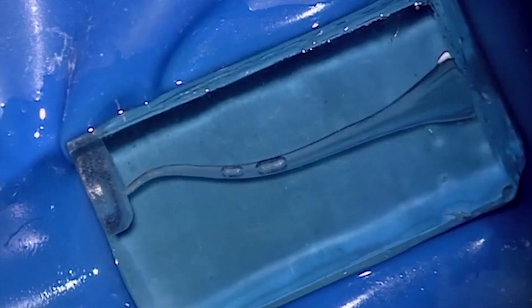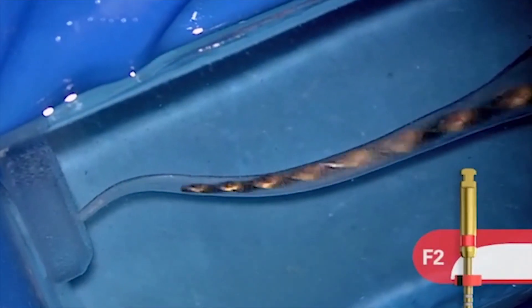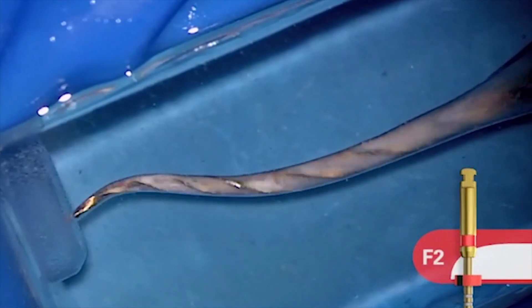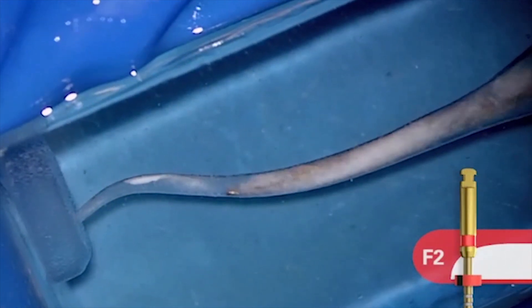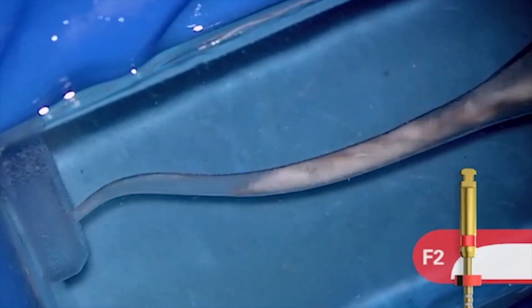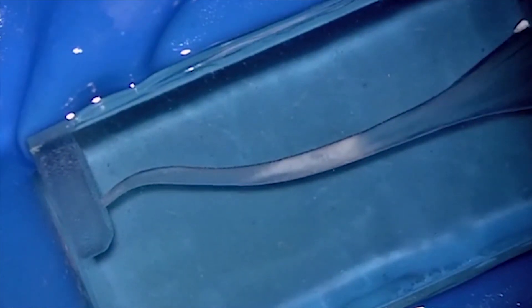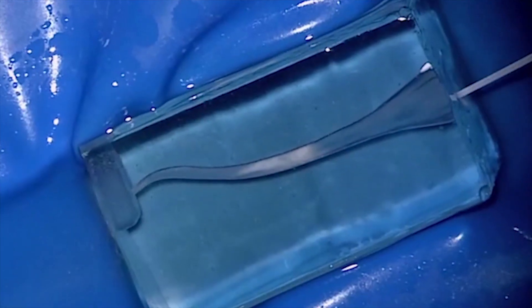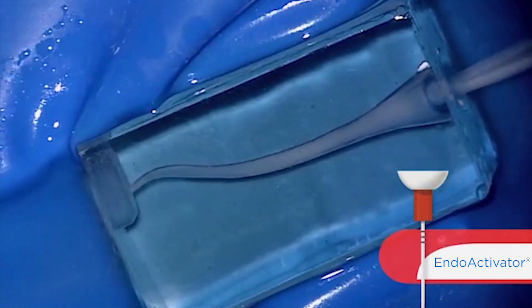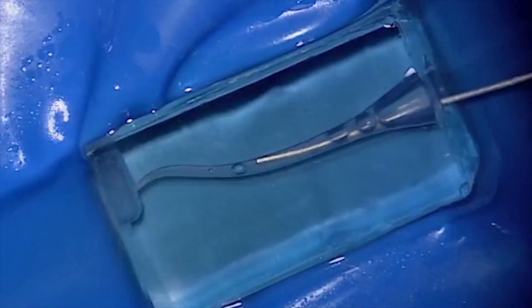Look at these files when they come out, especially the finishers, and see where they're cutting. We want to see debris on the more terminal blades of a file, which indicates that file just cut its shape in the apical one third. It would be needless to continue going to a higher level of files and expanding the diameter if the file is loaded — if it's loaded, we've just cut its shape and it's done. You can recapitulate this time with an EndoActivator, break up debris, and move it into solution. Notice how clean the canal gets rapidly by just following the EndoActivator in and agitating the solution.